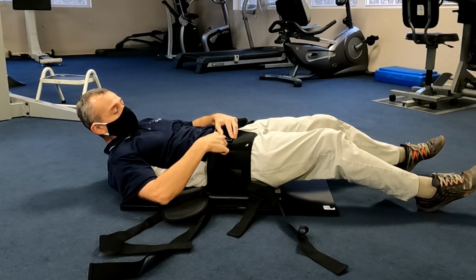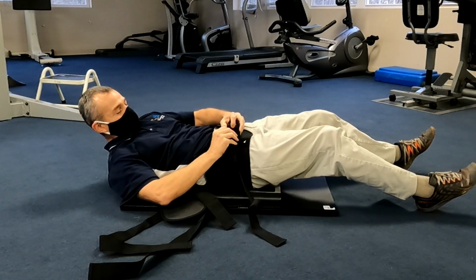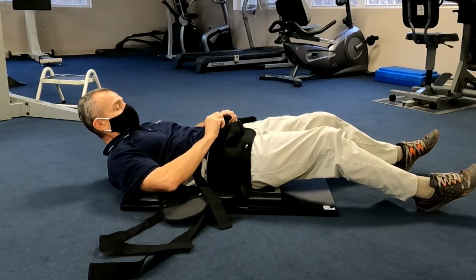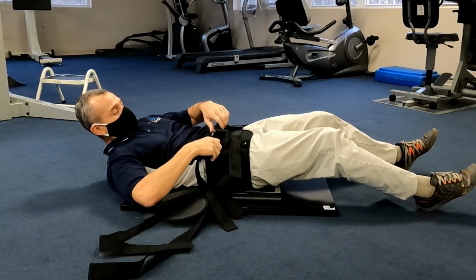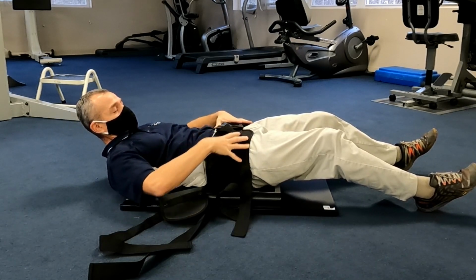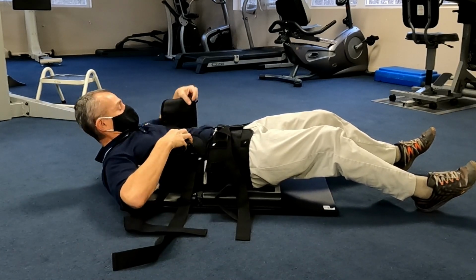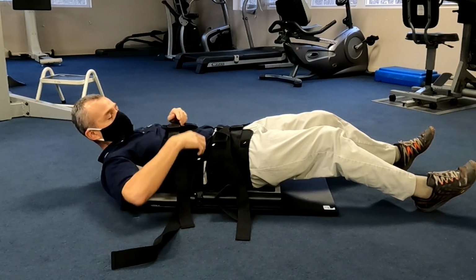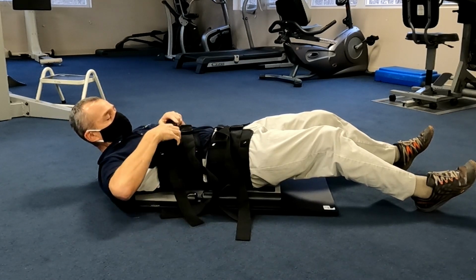Now, these guys will have to be adjusted. You're smaller than me, but I'm gonna give it a guess here. We want this to be kind of snug, but comfortable. So I get a little pull, pull. Here is my belt, and this strap is right at or below my belt level. Okay. Now this guy will come over. Same thing. I get a little bit of slack in the strap, a little bit of tension.